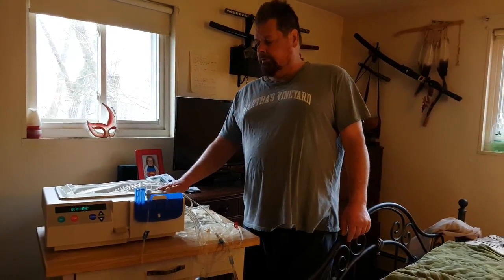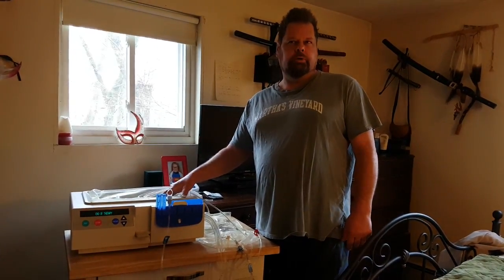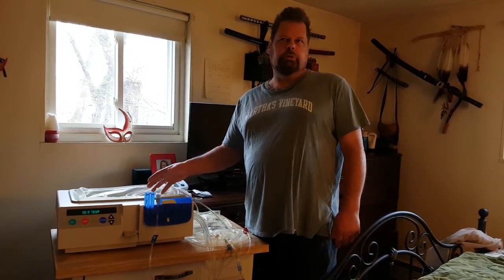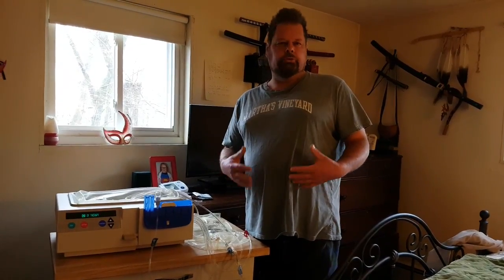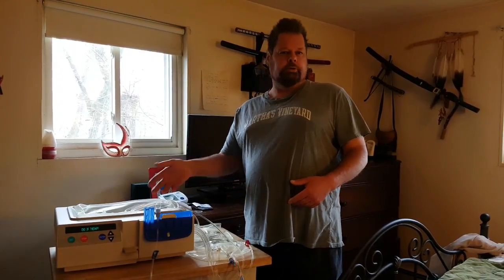Anyway, and then the cycler, what it does is it pumps a certain amount, I think it's 2,500 milliliters into your stomach cavity 5 times during the course of the night. And each time it dwells for about an hour. It sits there and it's taking out toxins. And so it's using your stomach cavity as your kidneys. And that's how it works. And it's removing all the toxins and the extra fluids that your kidneys normally would. And then it drains, and then it repeats. And it does that, like I said, 5 times.